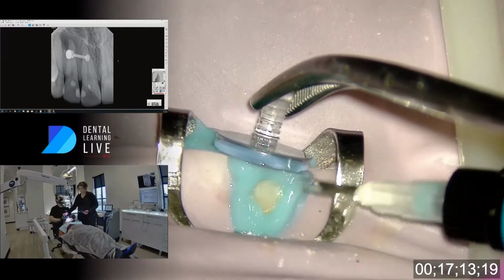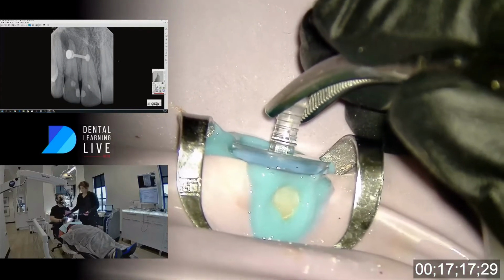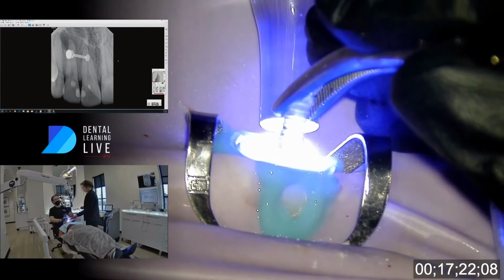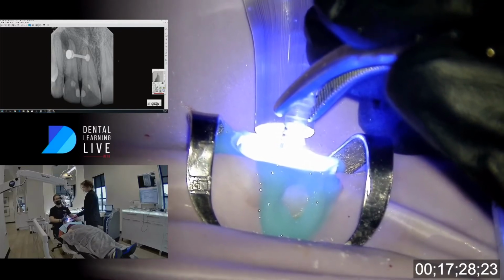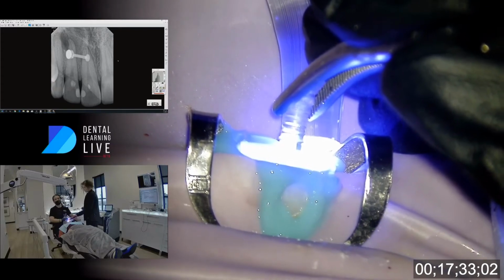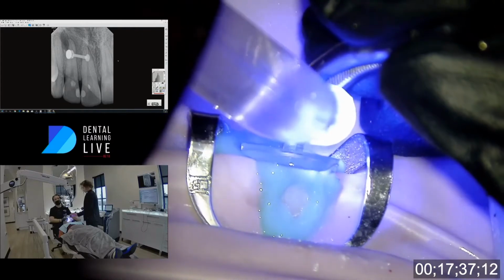Sometimes it's fun just to see a little bit of a tooth. Okay, I'll exchange this. Do you want to go ahead and cure that? Now, the platform to me is one of the most important parts of this thing, because creating the connection to the procedural instrument is where any of the flaws are. If it springs a leak, or if the seal breaks loose, then you're going to have issues. And so I really like to spend my time in getting this step right.